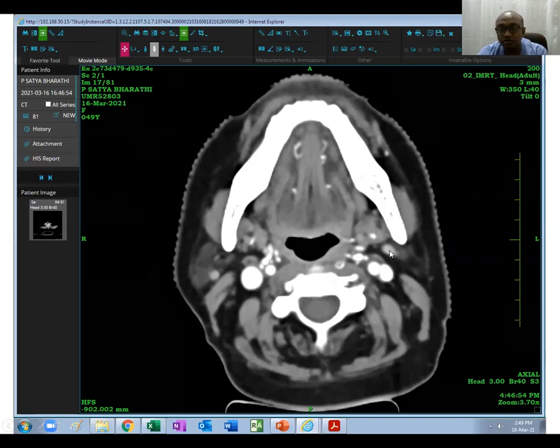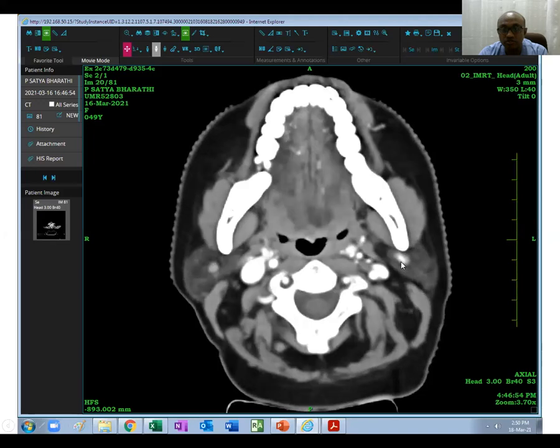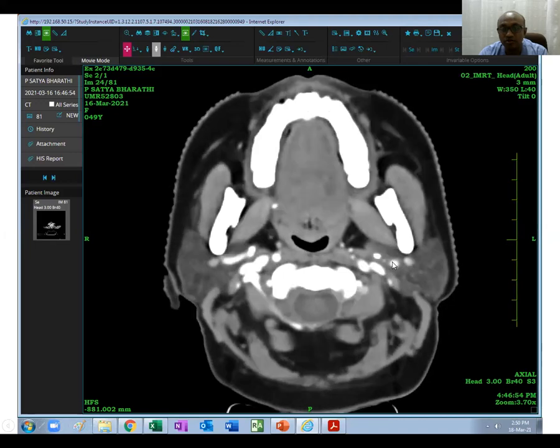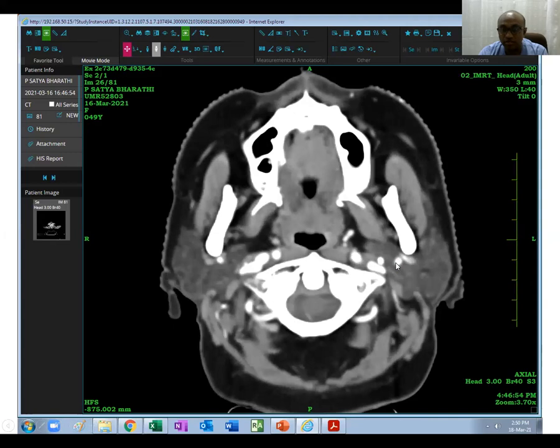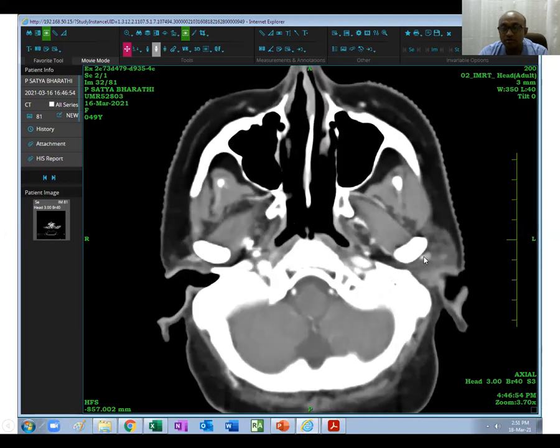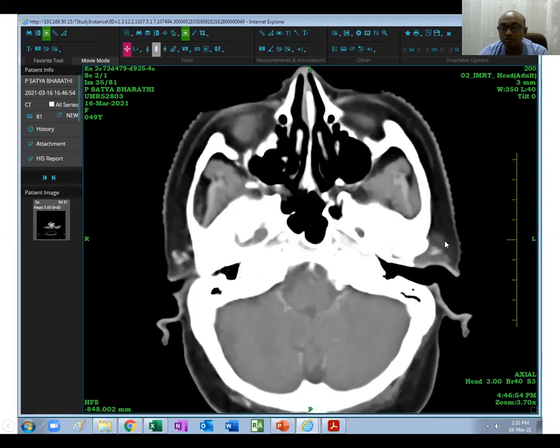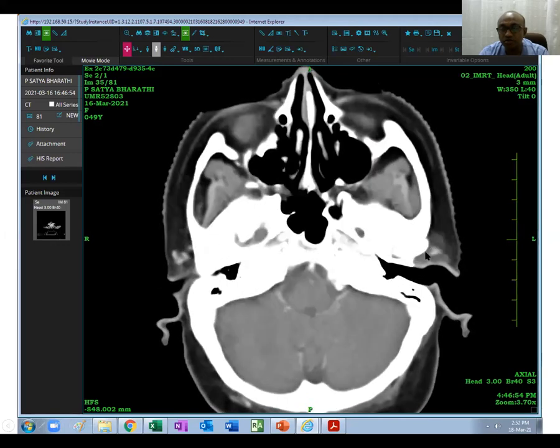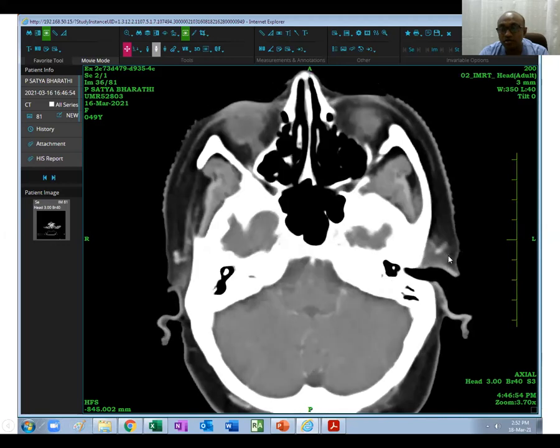Going from down upward, you can see the retromandibular vein and how it courses. Going further upward, you can see the external carotid branch coming inside, lying medial to the retromandibular vein. Going upward, the retromandibular vein continues as the superficial temporal vessels. You can also see some part of the parotid gland above the external auditory canal, so do not forget to contour this part of the parotid gland.